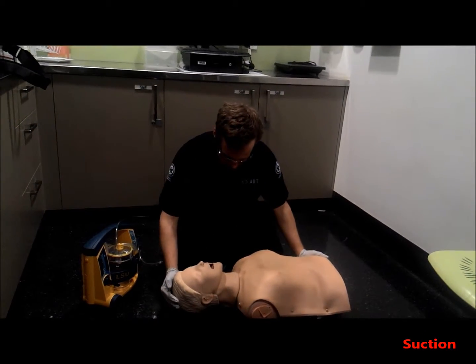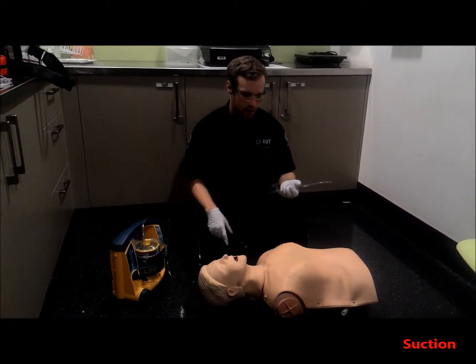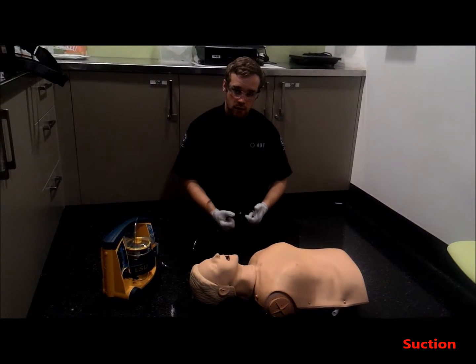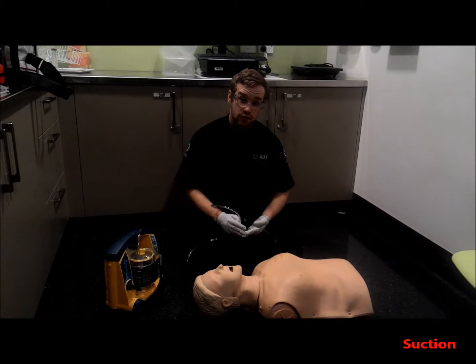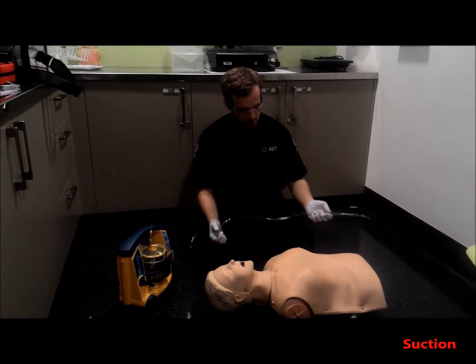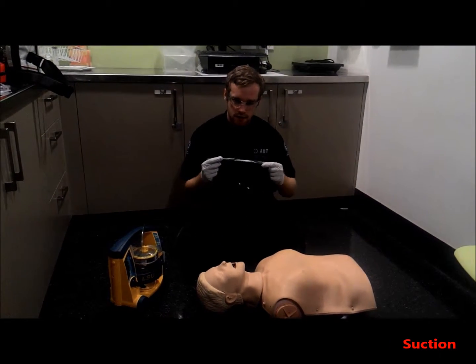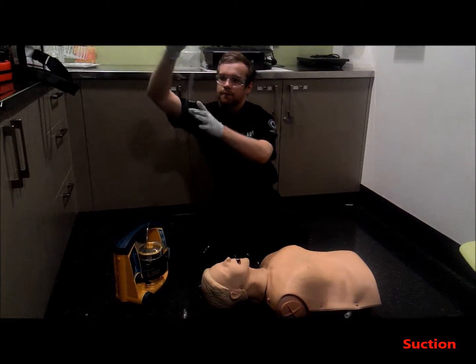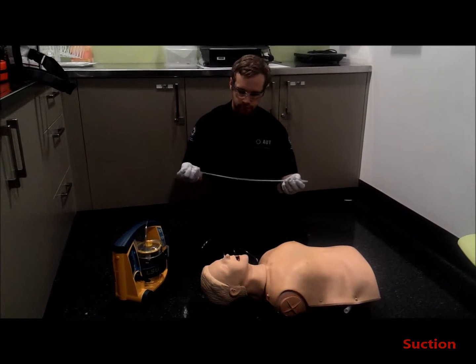So complications of this could include inducing vomiting or bradycardia, and also hypoxia, aspiration, soft tissue trauma. One other aspect of this is you should not use a rigid catheter such as this on a moving vehicle, but that you would use a soft catheter, something like this.